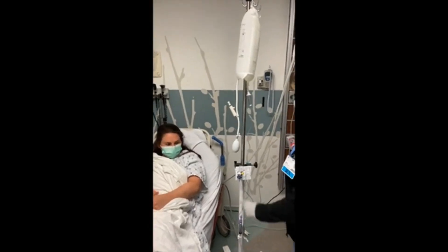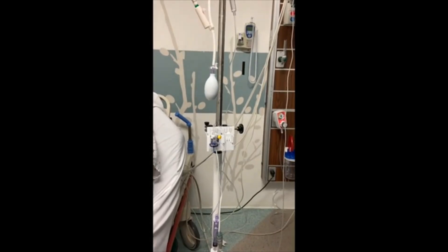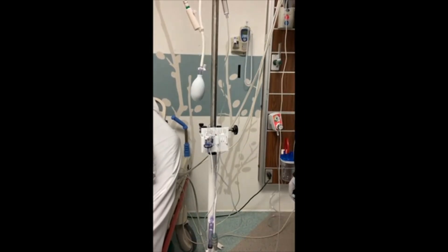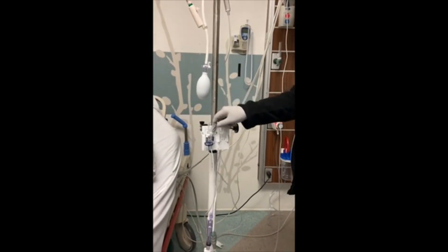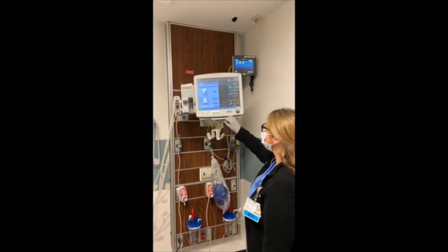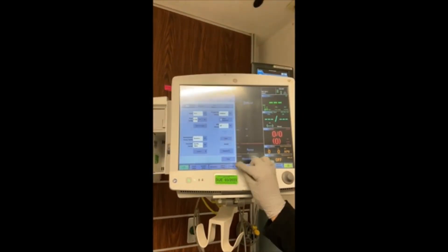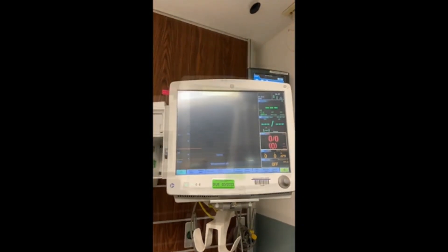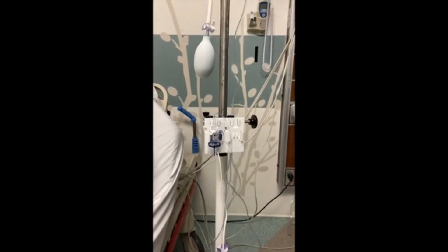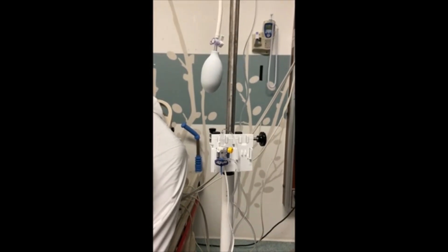Turn the stopcock at the transducer upwards, or off to the patient. Take the yellow cap at the transducer off. Now the tubing is off to the patient and open to air. Hit zero on the monitor, then hit zero ABP. Place a new yellow cap on the transducer. Turn the stopcock at the transducer horizontal — off to atmospheric air and open to patient.